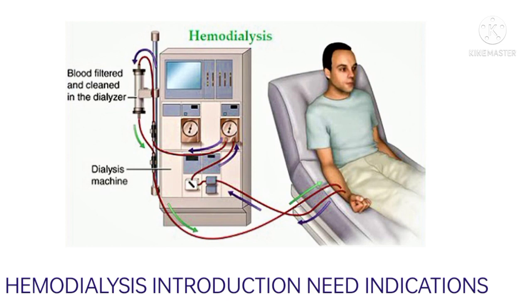Hemodialysis is the diffusion of dissolved particles from one fluid compartment to another across a semi-permeable membrane. The patient's blood flows through one fluid compartment and the dialysate is in another fluid compartment. Kidney helps remove extra water and waste materials like urea and creatinine from the body. Otherwise its accumulation would poison the body. Kidney maintains blood pH and pressure. Kidney failure prevents these basic functions from occurring.